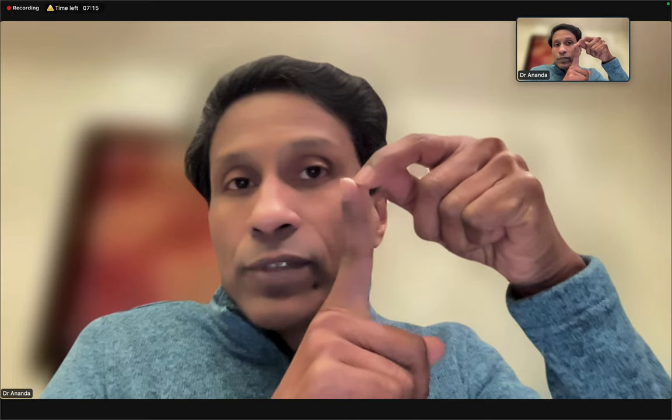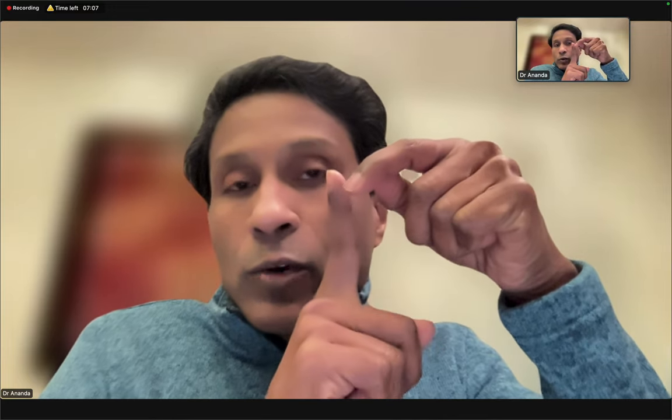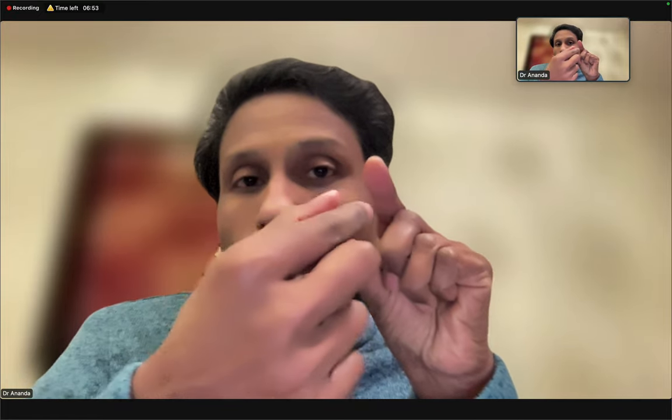The round tip baskets are quite useful if you are working inside the kidney, inside the calyces, where if there is no round tip, the string at the tip of the basket will prevent you from reaching the stone, while a round smooth tip will go to the base of the calyx and help you to catch the stone. These things possibly you all will know. So use an open tip basket. The advantage of the open tip basket is, again, if your stone is stuck, you can open the basket, and if you come out a bit, the stone may fall off quite easily compared to the closed baskets.